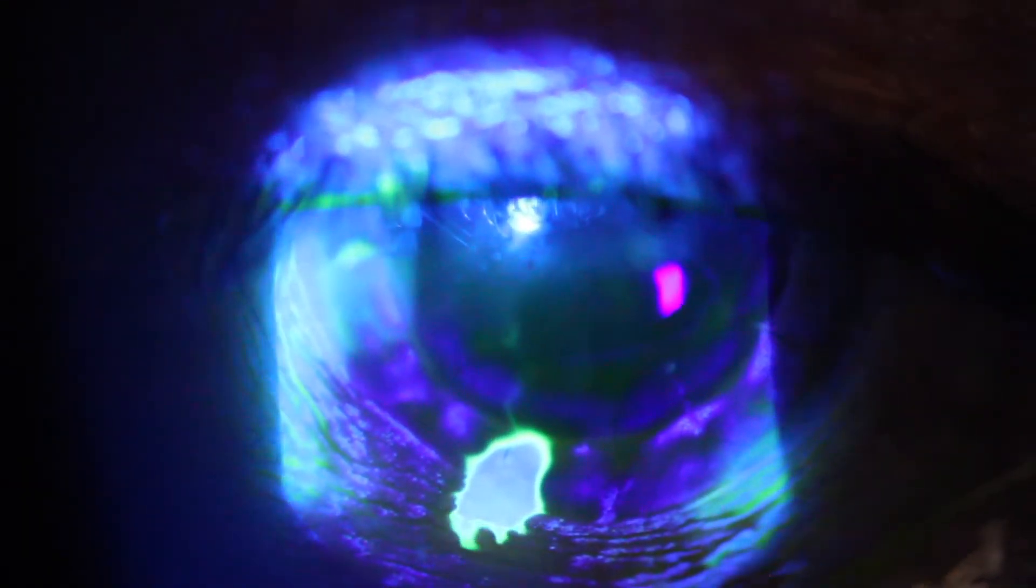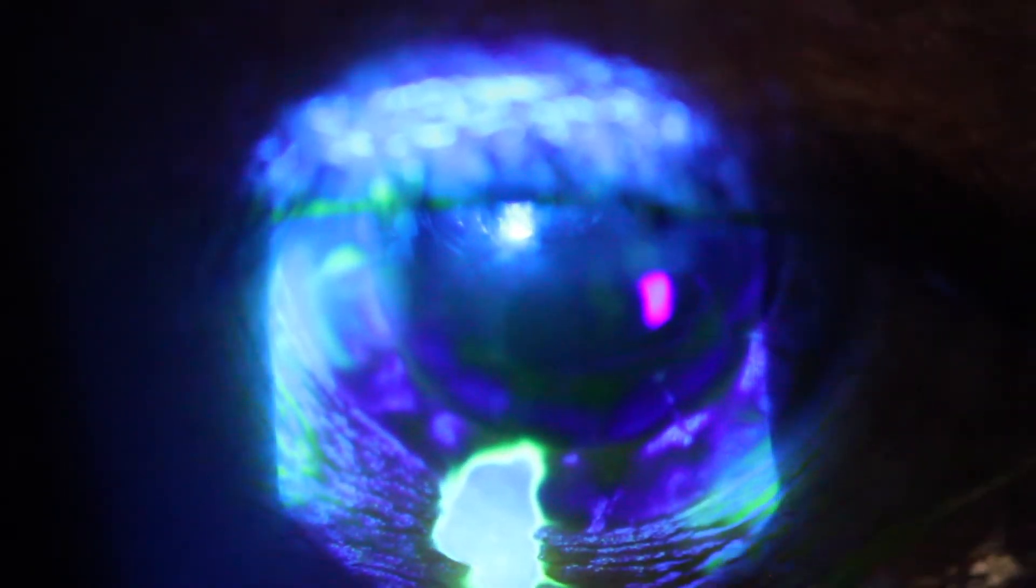You can see here I've instilled 2% fluorescein into the eye, the patient blinks, and aqueous is coming from the anterior chamber out of the corneal perforation, or in this case out of the junction between the patient's host cornea and the corneal graft, washing that fluorescein away.